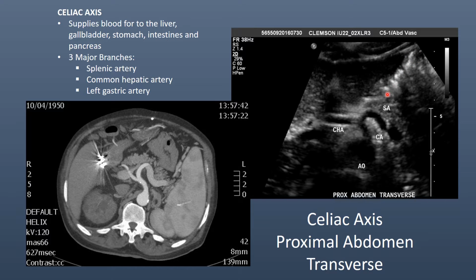Also want to point this out. This is one of the things we have to fight in the abdomen. This is bowel gas. So when ultrasound hits air, it just scatters and makes this foggy type image that's very difficult to see behind. So that's something the sonographer has to be aware of when they're dealing with abdominal imaging, and we have to work around this, and we'll be talking about that in other tutorials within this learning module.